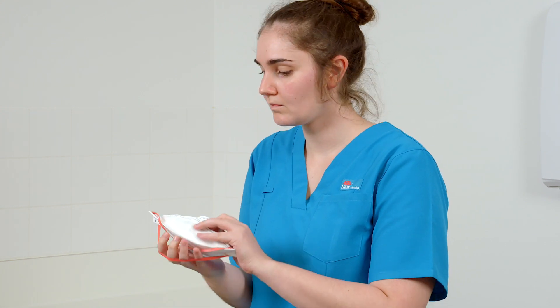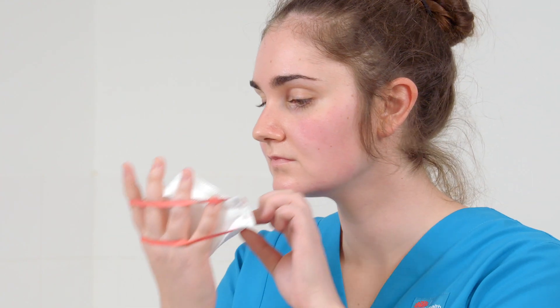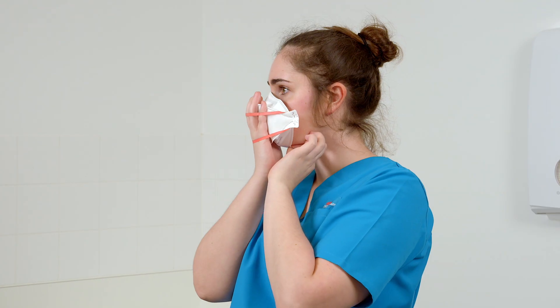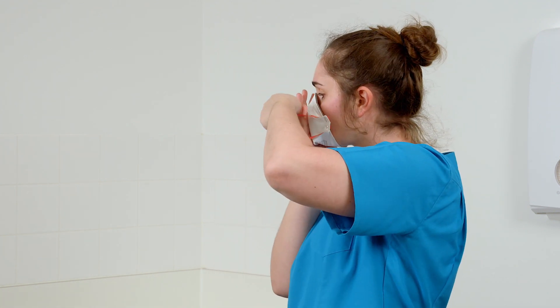Cup the respirator in one hand with the open side towards your face. Place the respirator on your face so that the foam rests on your nose and the bottom panel is securely under your chin.